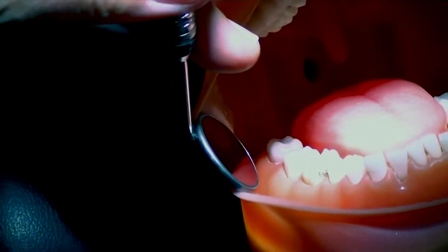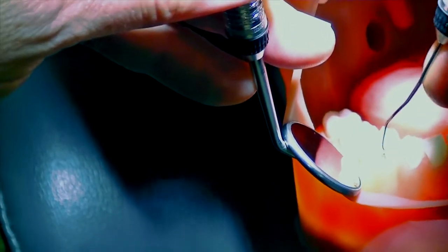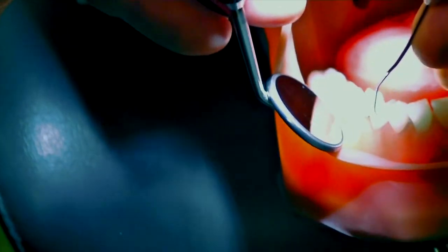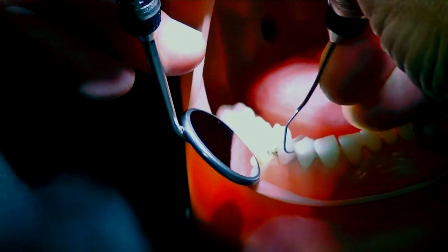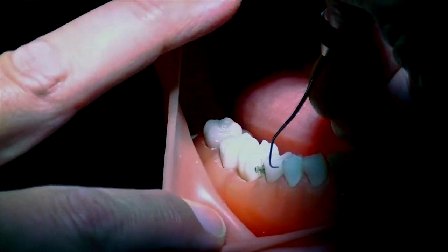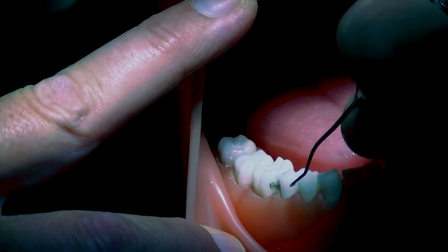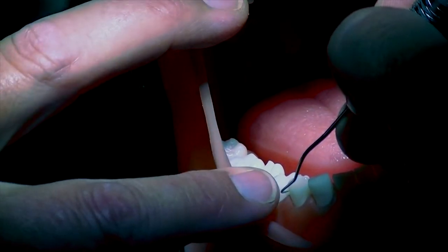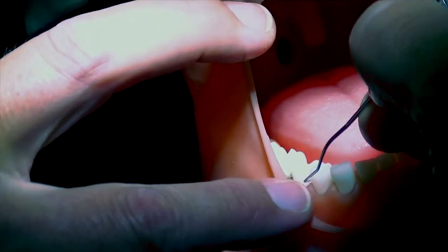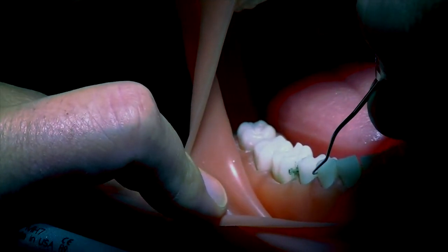So fourth quadrant, in the posterior area, point fulcrum where your fulcrum position is. Point the tip interproximally in between the teeth, and your terminal shank should be parallel to the long axis of the tooth. With the wrong end, if you did the same activity interproximally with the tip, your terminal shank is on a diagonal to the tooth. It's the wrong end.